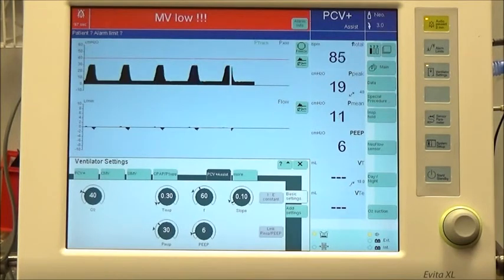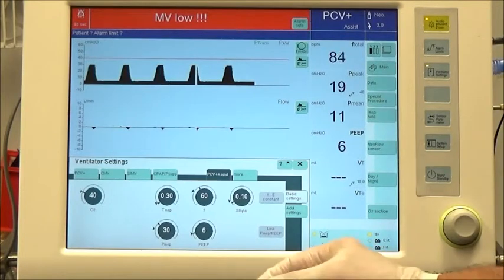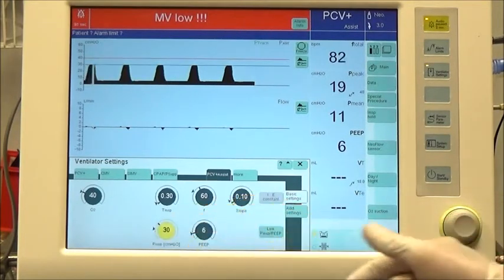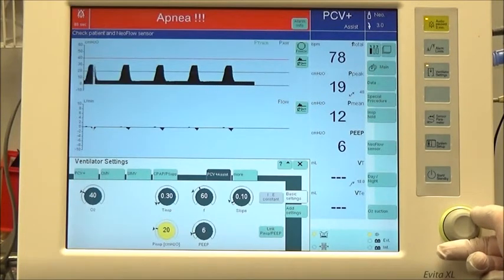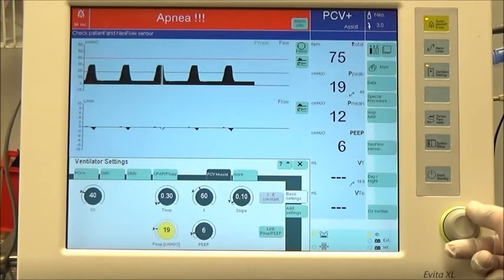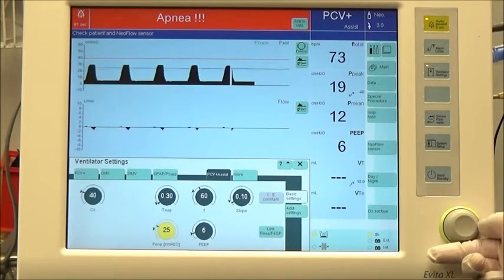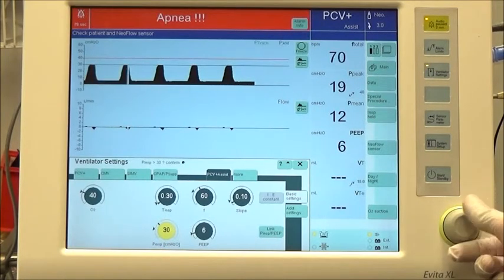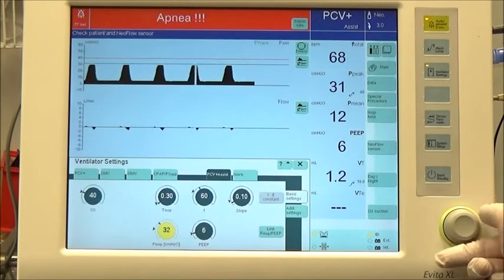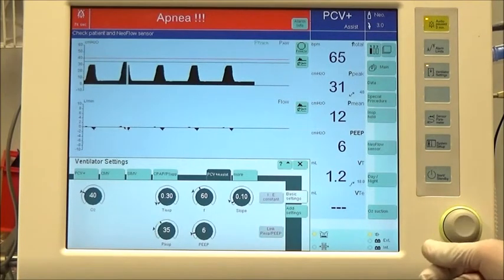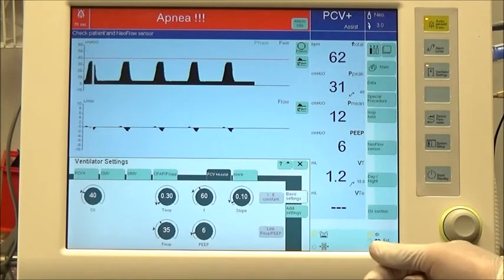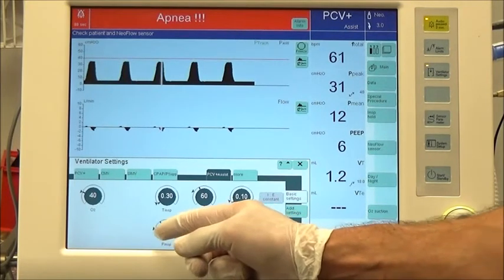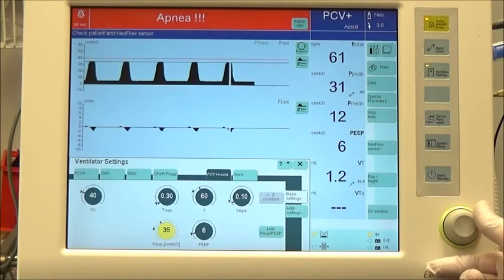If ventilation does not re-establish, increase the PIP to 35 cm of water pressure and assess over 15 seconds. If ventilation re-establishes, wean the PIP targeting a goal volume of 4 to 5 mL per kg.